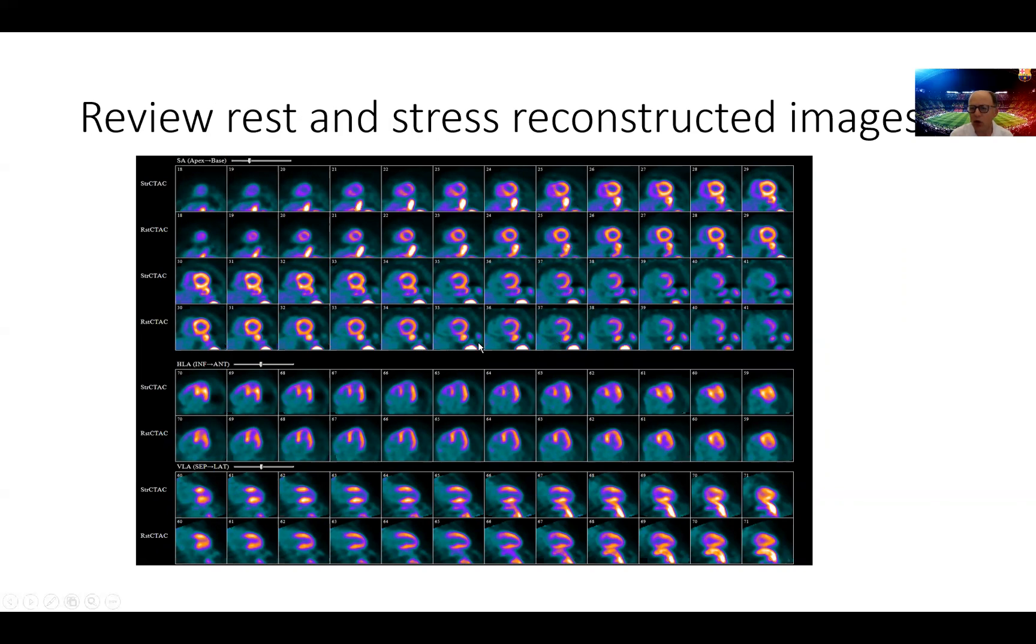And we go over the rest images first, where we can see displayed here, the short axis images of the left ventricle on the bottom, going from the apex to the base, with some GI activity here, but not interfering with the interpretation of the images.